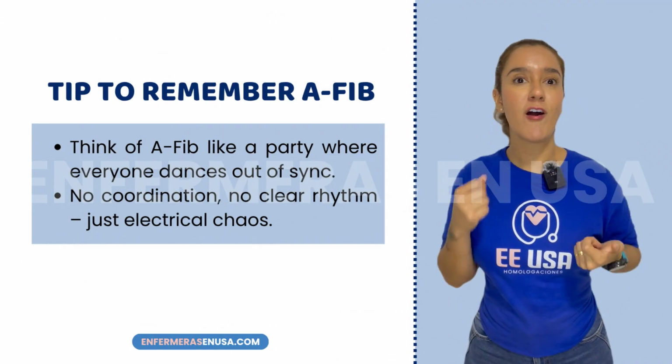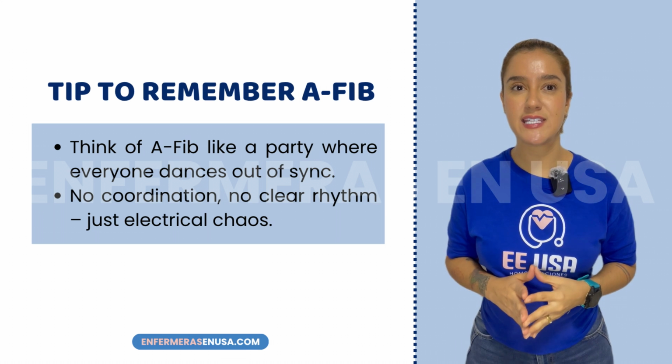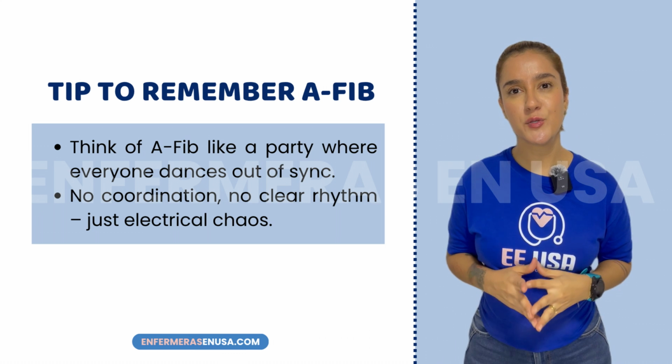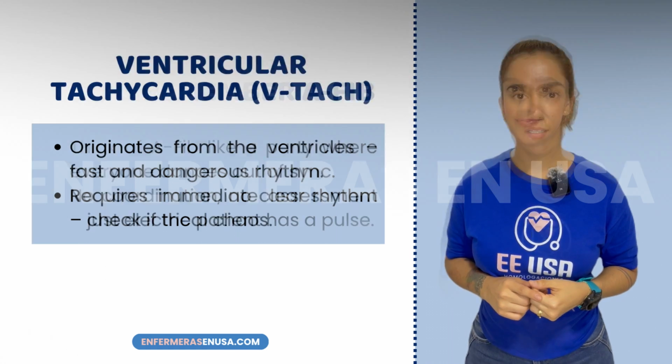Think of the word party. Atrial fibrillation is like a party where everyone dances out of rhythm. No one follows the music, and that's why the rhythm is irregular and unpredictable.